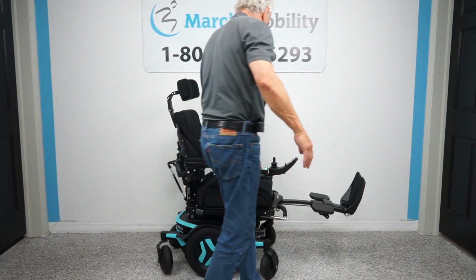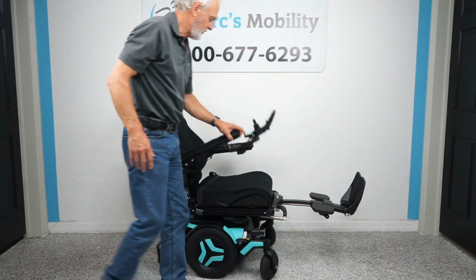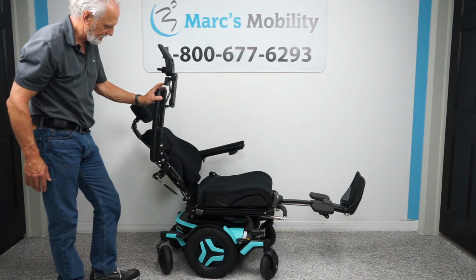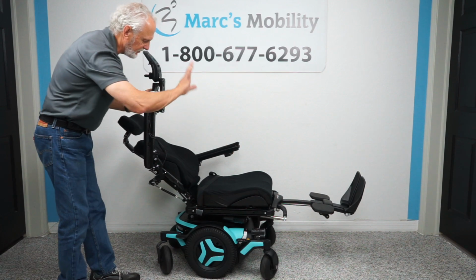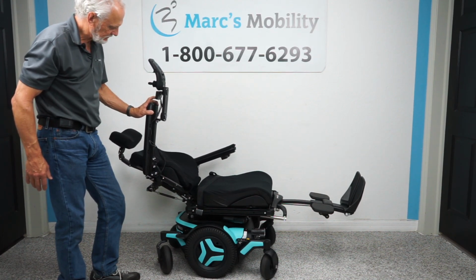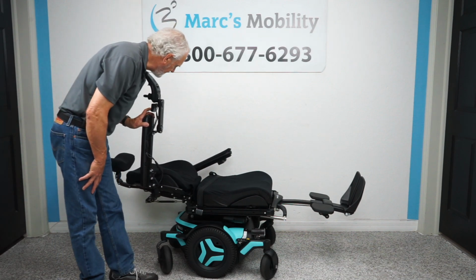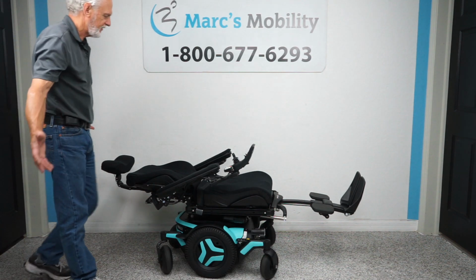The last one we have left is called the electric recline. The recline is when the back right here, let me raise the arm. The back is going back, nothing else is moving. This is called the electric recline. A lot of people confuse this for the tilt. That's the recline, we already did the tilt. These chairs are so amazing. So it's a full recline that you can see, folks. If you were laying down in your chair, that's what it would look like.